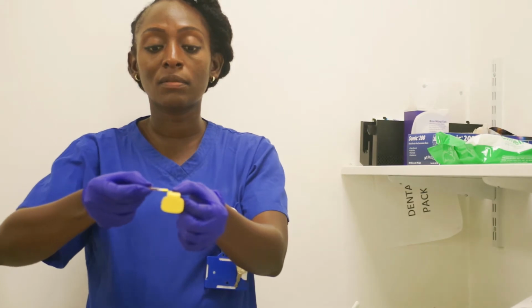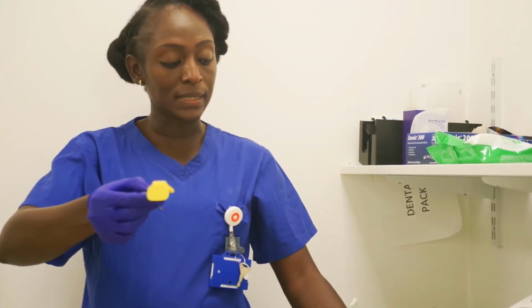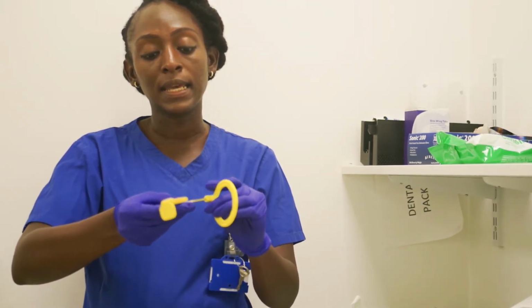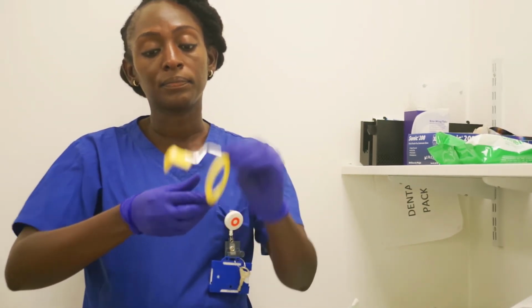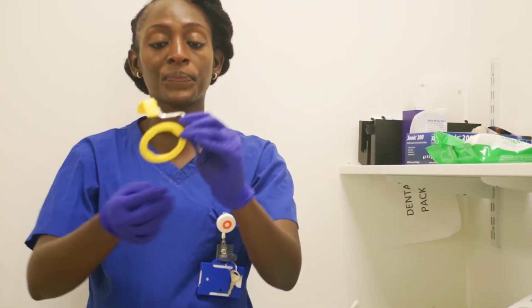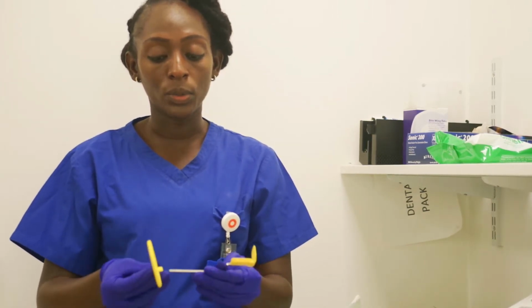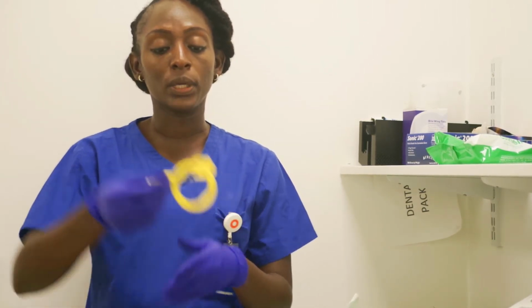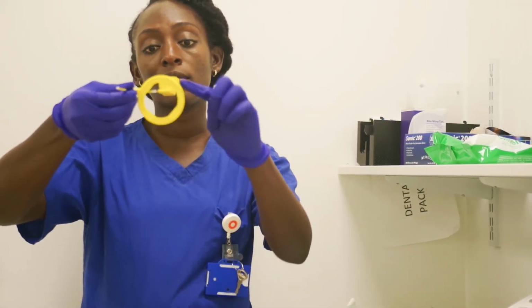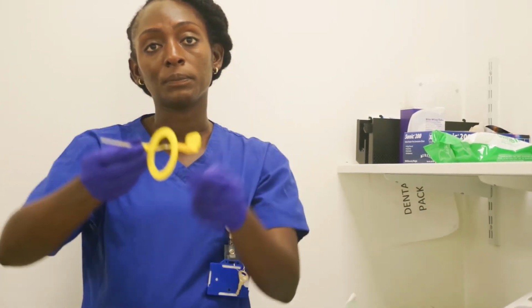Okay, so this is the right hand side of the bite piece, and then you assemble this circle such that you can see the phosphor plate or the film if you have it. And when we went through errors and artifacts, you remember that when we assemble it the wrong way, we won't get anything. So this is not what you want to do. You want to make sure that this ring is focused on where the receptor would be.